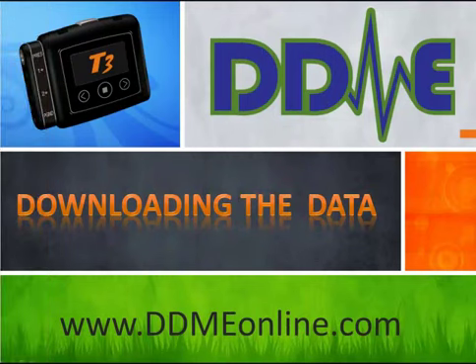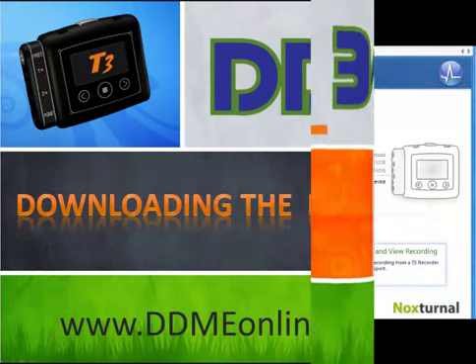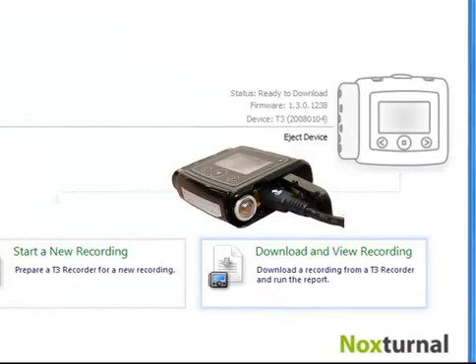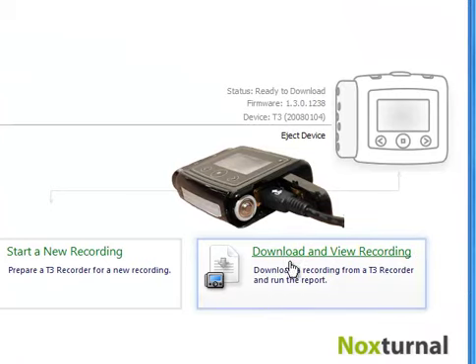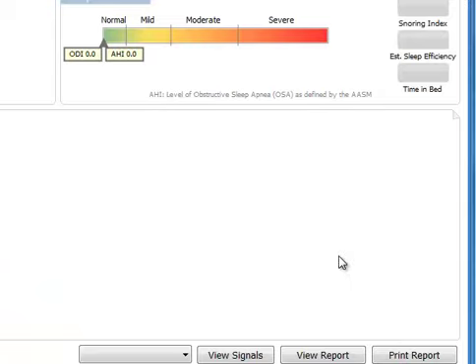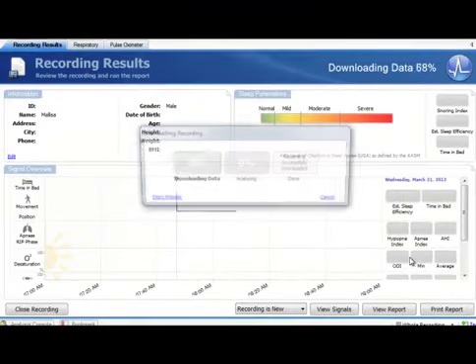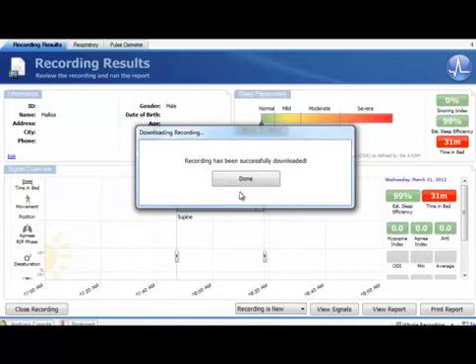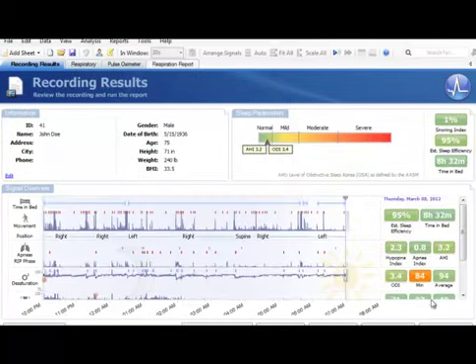Once the patient has brought back the T3 from the overnight home sleep test, open the battery door and plug the USB cable into the T3. This time, click 'Download and View Recording,' and the data on the T3 will be automatically transferred to your computer and auto-scored at the same time. When the download is complete, click Done, and you'll be presented with the Recording Results page.